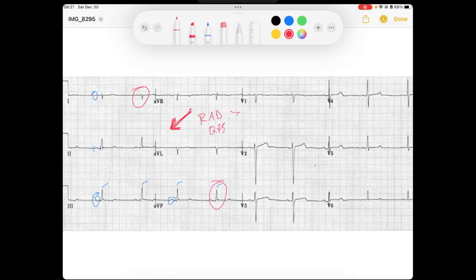And on that right axis deviation, the first thing I should think of is what's my differential diagnosis? Is it right ventricular hypertrophy? So I look at V1, and I see in V1, I should have an R wave that's greater than 7 millimeters for RVH, which I don't see. It's just a small R wave. And so I'm like, okay, I've excluded RVH.